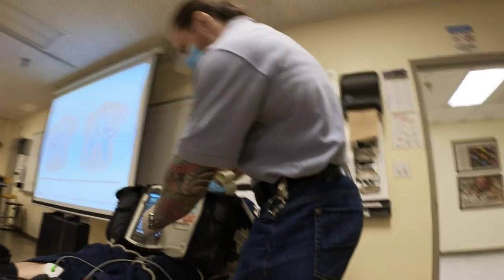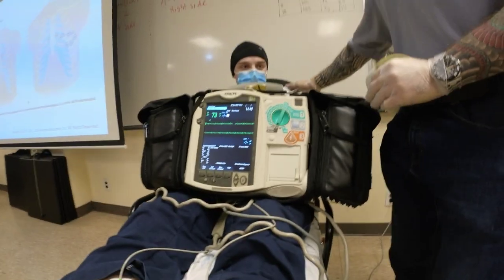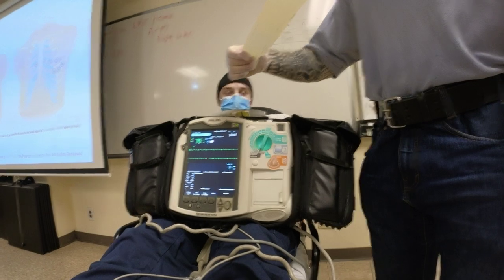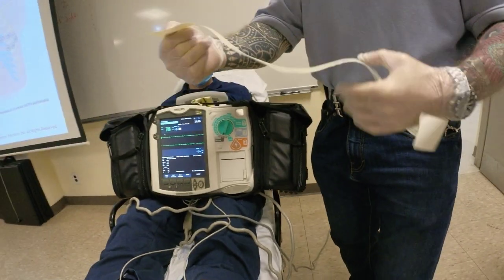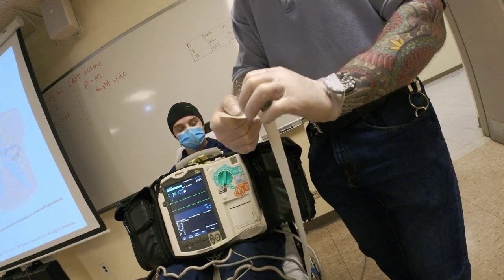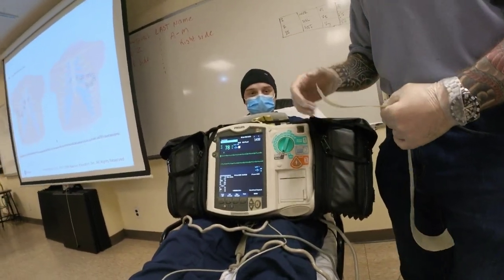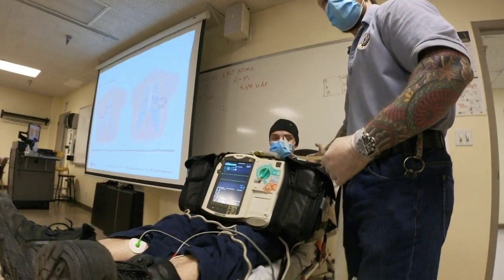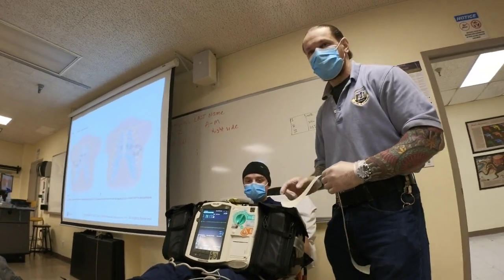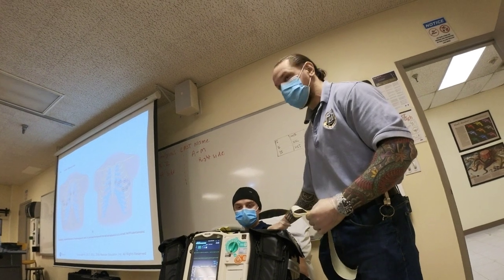So the machine is going to give you its own interpretation. You're not having a STEMI, sir. It will tell you the interpretation, and you'll get a printout. If the printout still has some waveform that's not clear cut, or the baseline is not good, I would do another one. Just say, don't move. Maybe make him more comfortable, put some more padding so he's sitting there relaxing. Any questions about how to apply?